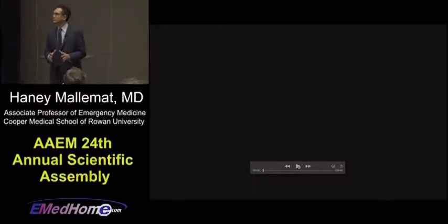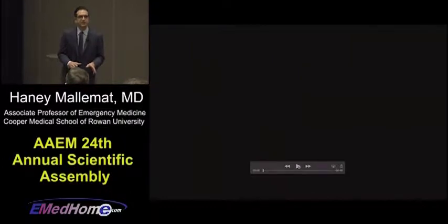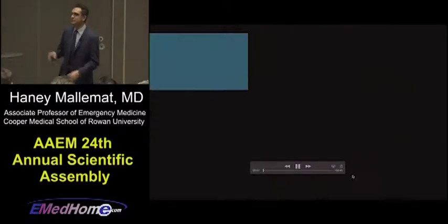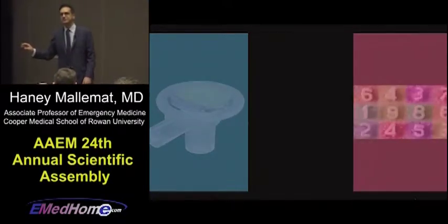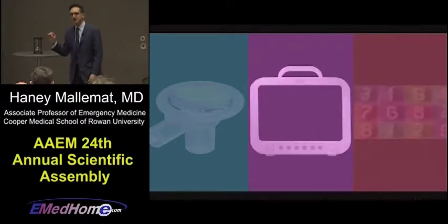End-tidal CO2 is one of the most powerful tools that we have in our emergency department. We can use qualitative end-tidal CO2. We use that on a daily basis. You might also be using quantitative end-tidal CO2. But today, I want to talk to you about waveform capnography.